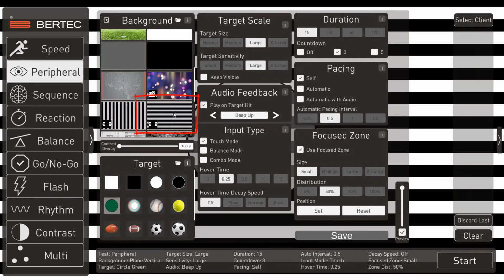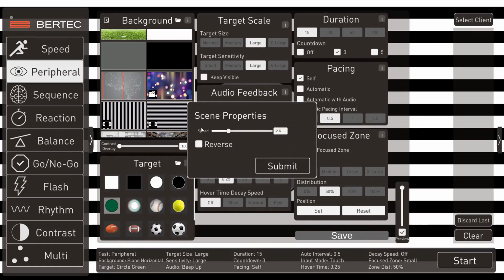Here we'll switch to a vertical motion. Don't be surprised if you get a significantly different response when you change orientation. These type of stripes will especially bother people when they're going up bleachers or walking down a pier or have patterns on the floor.